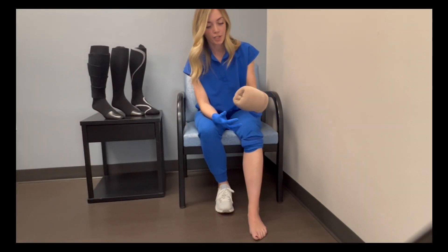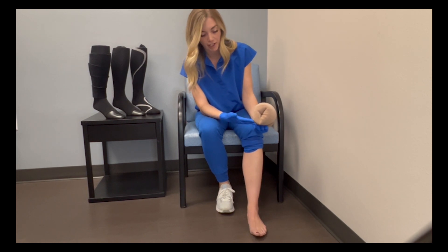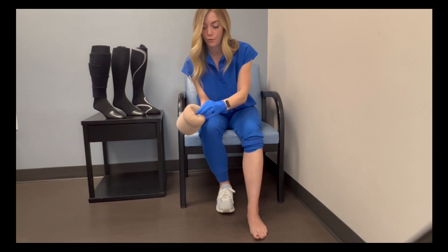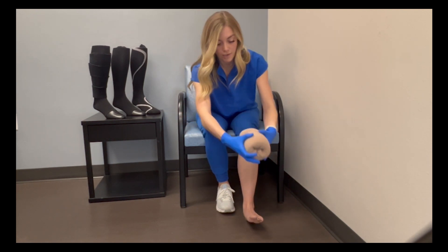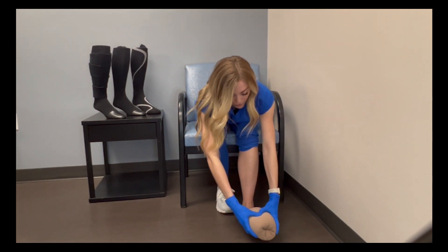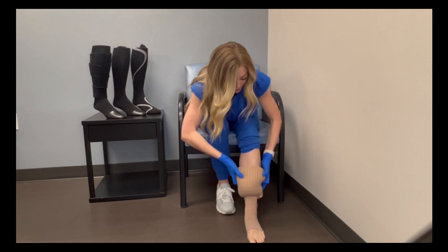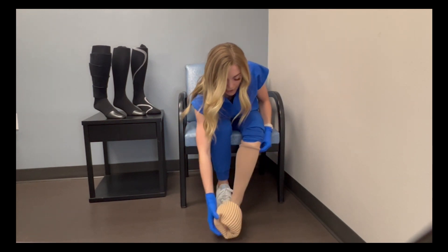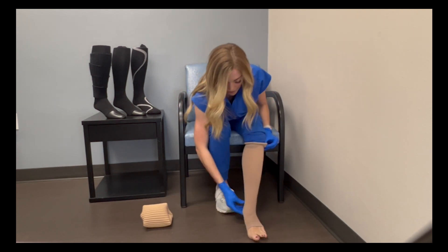Alright, so our next step is putting on the compression sock after we've got it rolled onto our jelly donut. Here I have my heel, which is going to be facing to the floor, and then I have my opening of where my foot is going to go. So I put my hand on the back side here and slip this over my foot like so — it just gets rolled up the leg. Once I feel like I've got it rolled up as far as I would like, I can take the donut off to the side and then adjust your sock.